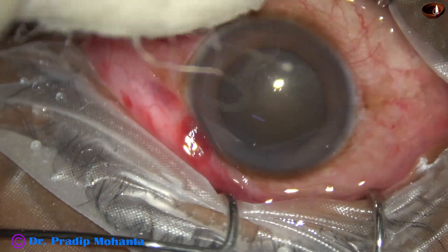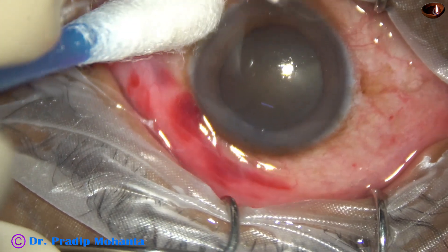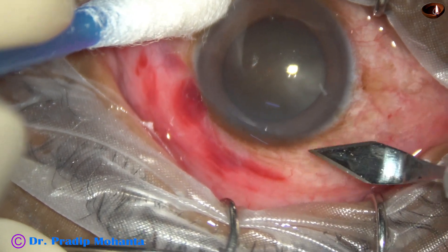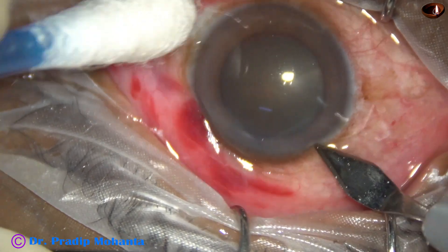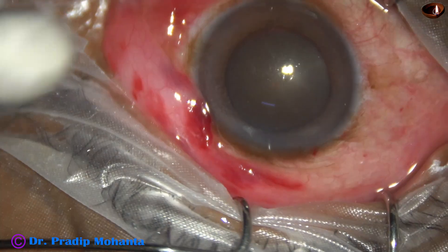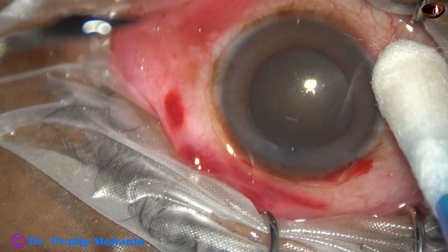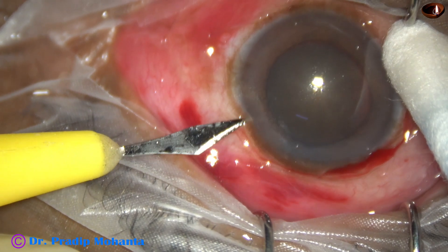This is a hard cataract with very weak zonules — we will see that in a short time. This is the main incision with a 2.8 millimeter steel keratome. A side port is being made on the left side of the main incision.